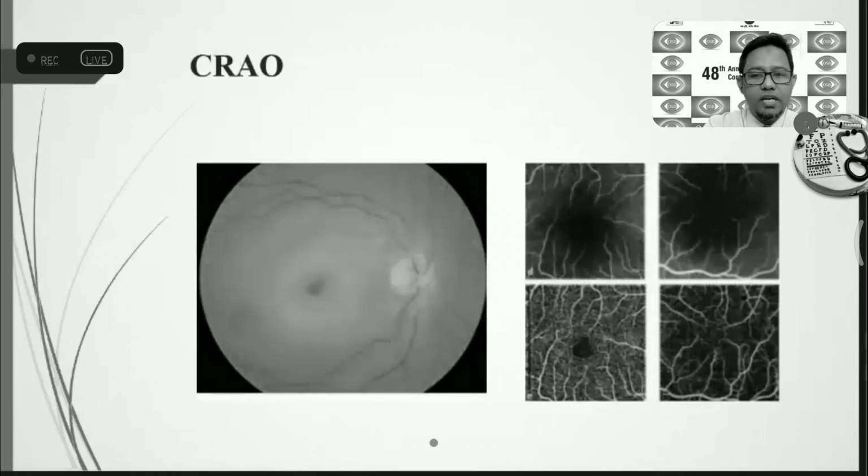In case of central retinal artery occlusion, the color fundus shows a whitish appearance of the macula and the entire posterior pole. The macula appears as a dark cherry red spot, and angiography in the similar regions demonstrates significant changes in capillary network and overall capillary impairment. The deep capillary plexus is not visible, replaced by the superficial capillary plexus. This is also the projection artifact.